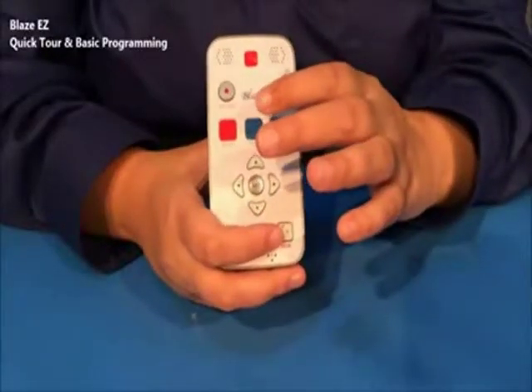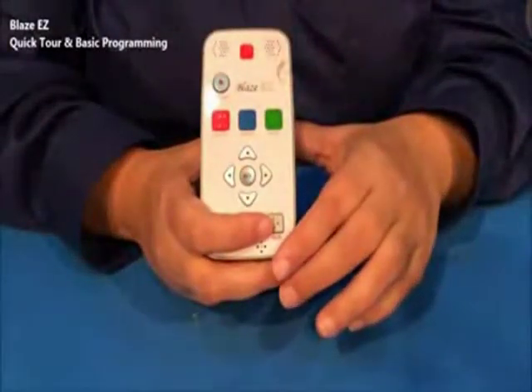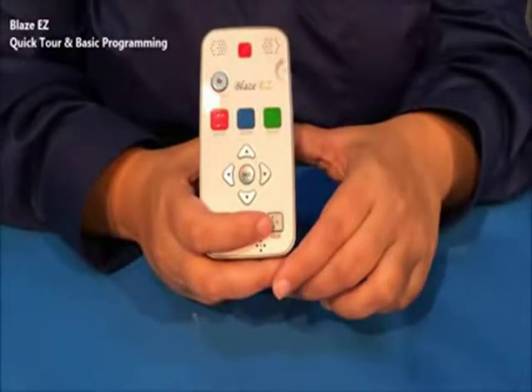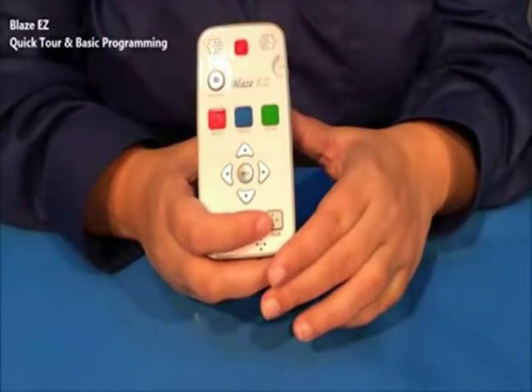Below the record button is a row of 3 buttons with Braille labels. On the left is a button with the label M, which opens the media player. In the center is a button labeled with an R, which opens the FM radio. On the right is a button with a label B, which is labeled for the book reader.